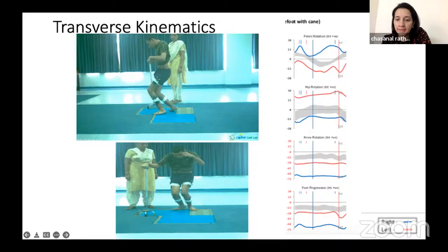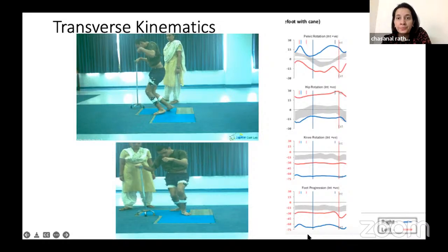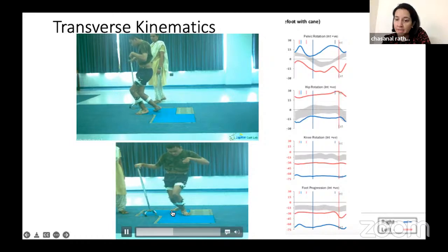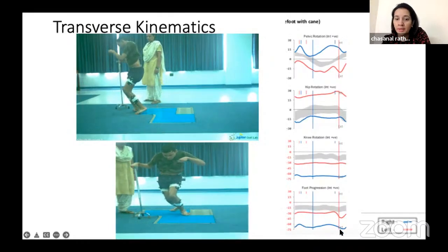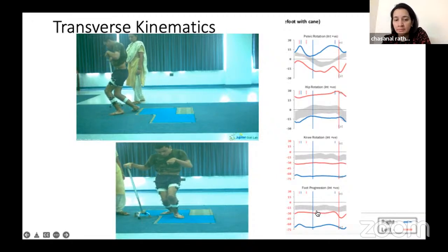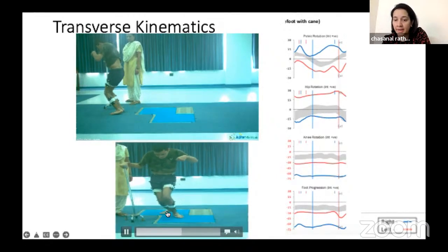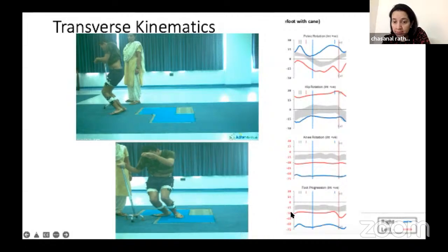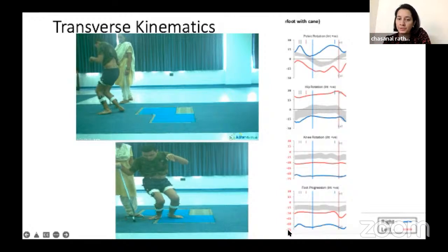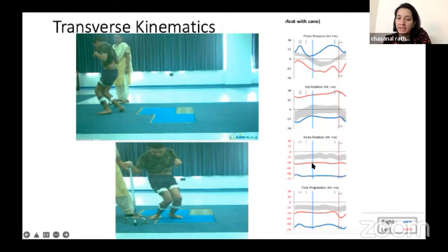So if you look at this, let's start from the foot. The right side is externally rotated. Of course, we can see that it's too much external. And the left is probably near the neutral, but yes, it is still external, but not as much as the right side. So it's still 30 and this is like 75 somewhere around. So there's a lot of external rotation in terms of the FPA.